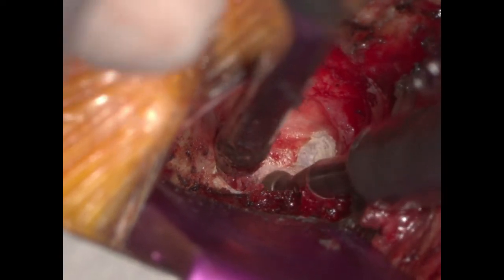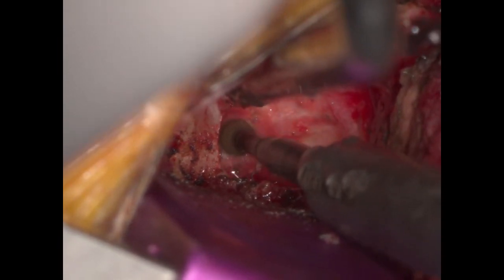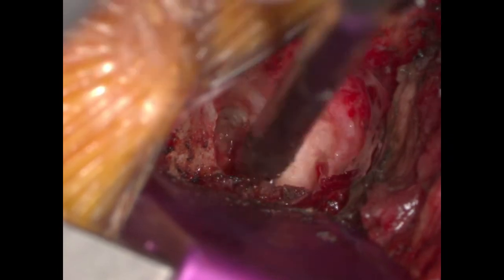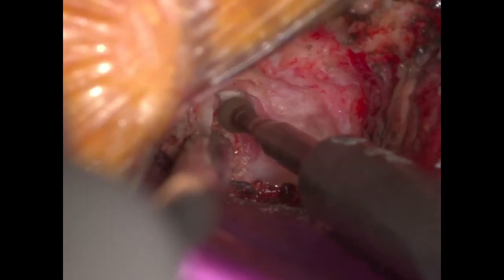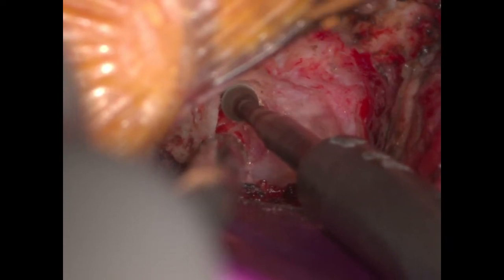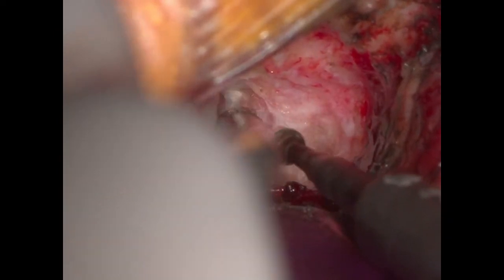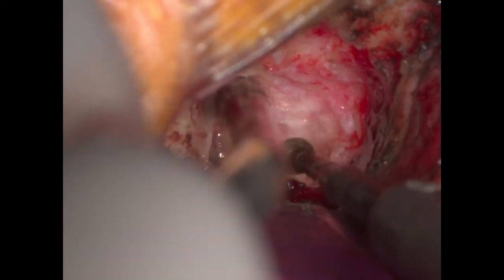Here we have the diamond drill drilling the superior articular process of C7. We then proceeded to drill down into the pedicle of C7, which is ventral to the C7 nerve root. Often there is some bleeding from the cancellous bone of the C7 pedicle.